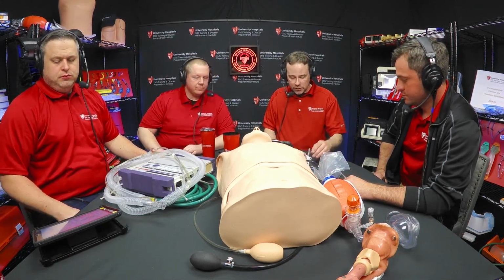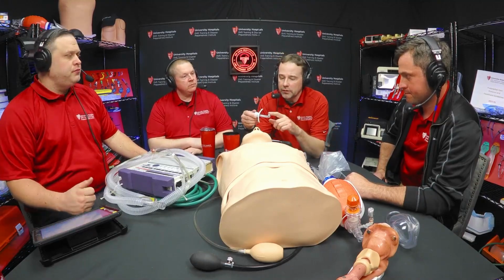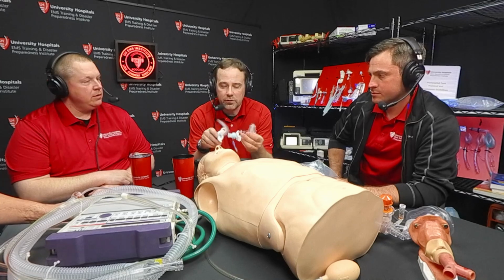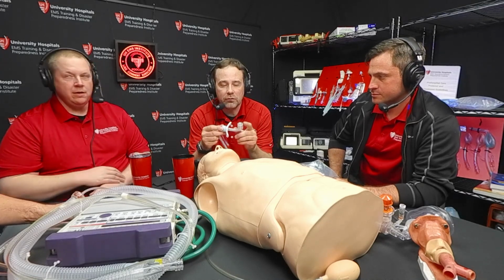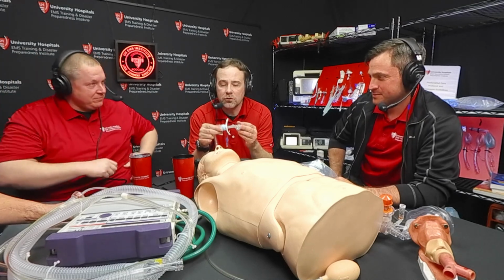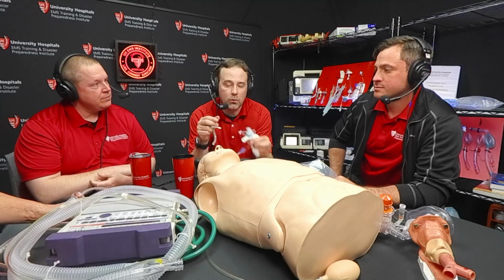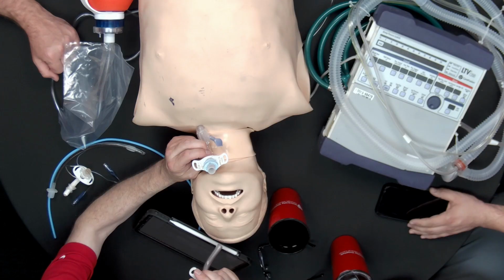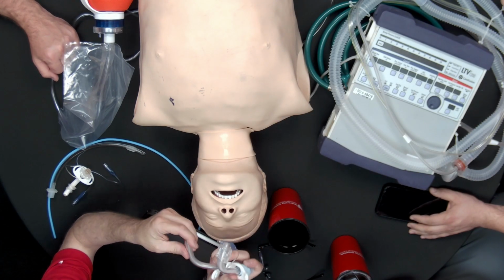In general, there are two types of tracheostomies. There are uncuffed tracheostomies that have no distal cuff here, and then we've got cuffed tracheostomies, either the exact same size and type, but one is cuffed and one is uncuffed. You can see this has a distal cuff down here, and this works just like the cuff on our endotracheal tube, conceptually, although it's much shorter because we're accessing the airway more directly, in the neck rather than top down. So we don't need all that extra length, and it's a little more rigid than your endotracheal tube.